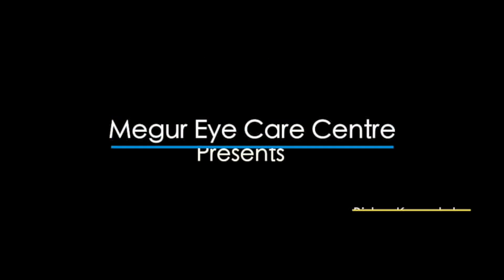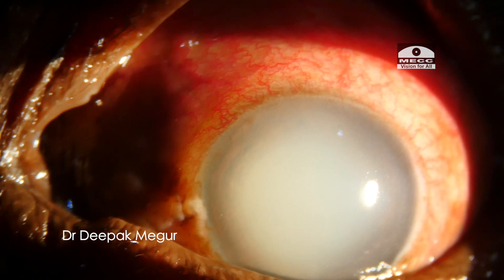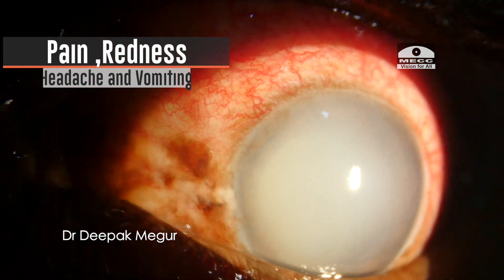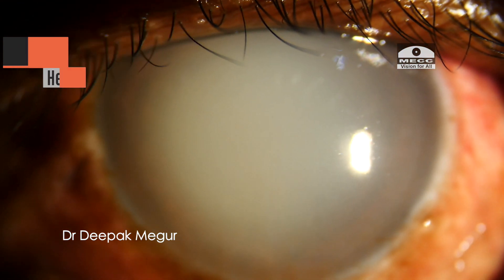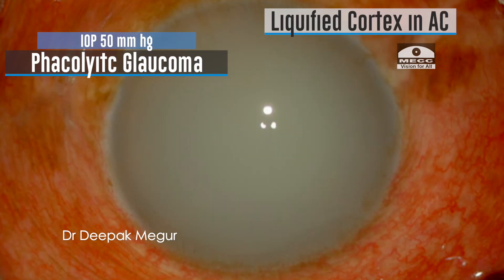Hello friends. I have an interesting case today — an elderly patient who presented with a lesion which on casual examination would probably look like a corneal opacity, but in fact the patient was having severe pain, headache, and vomiting. This was a case of lens-induced phacolytic glaucoma, and this white appearance is actually the liquefied lens matter which has filled up the anterior chamber, something like a pseudo-hypopyon.